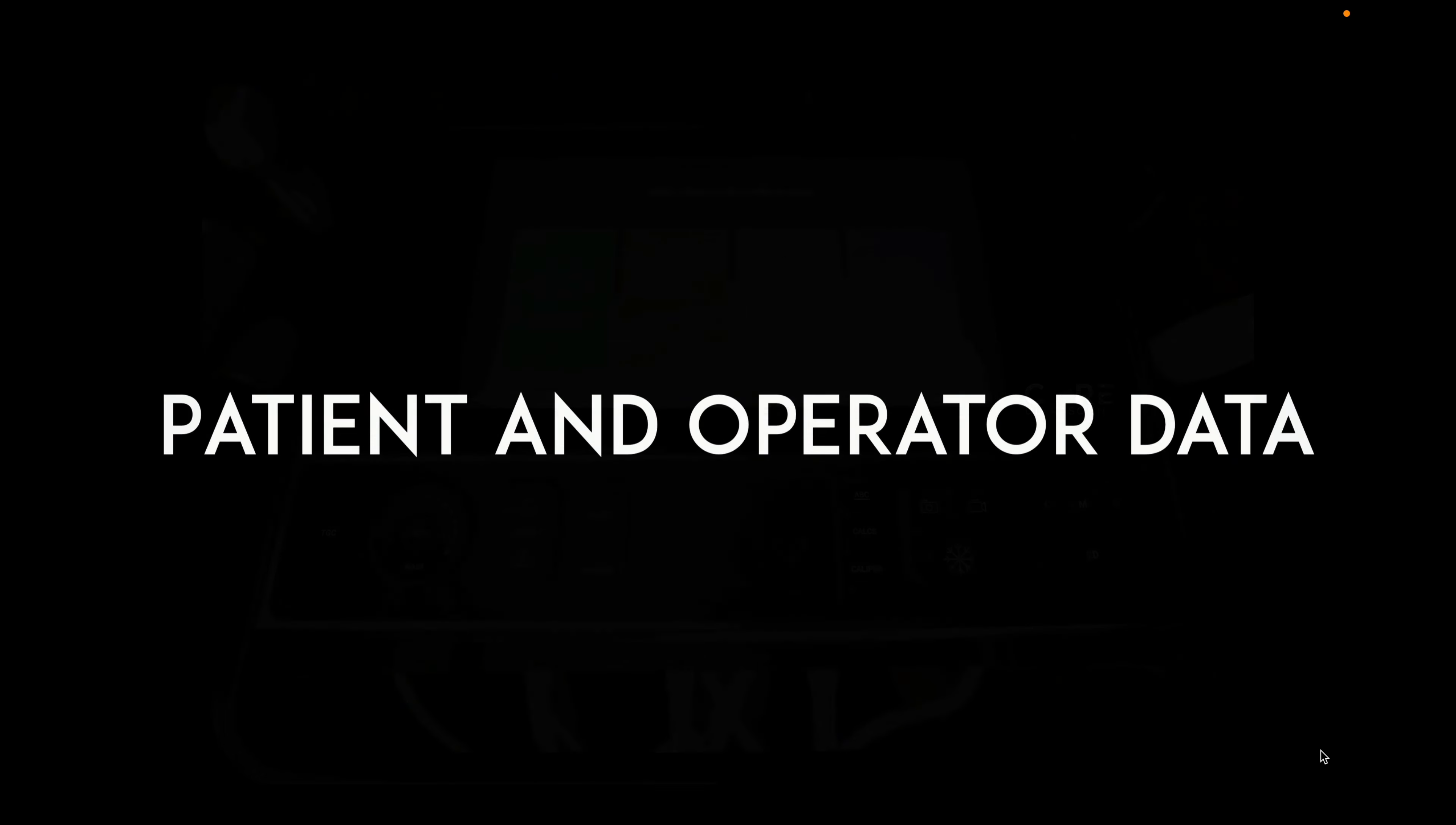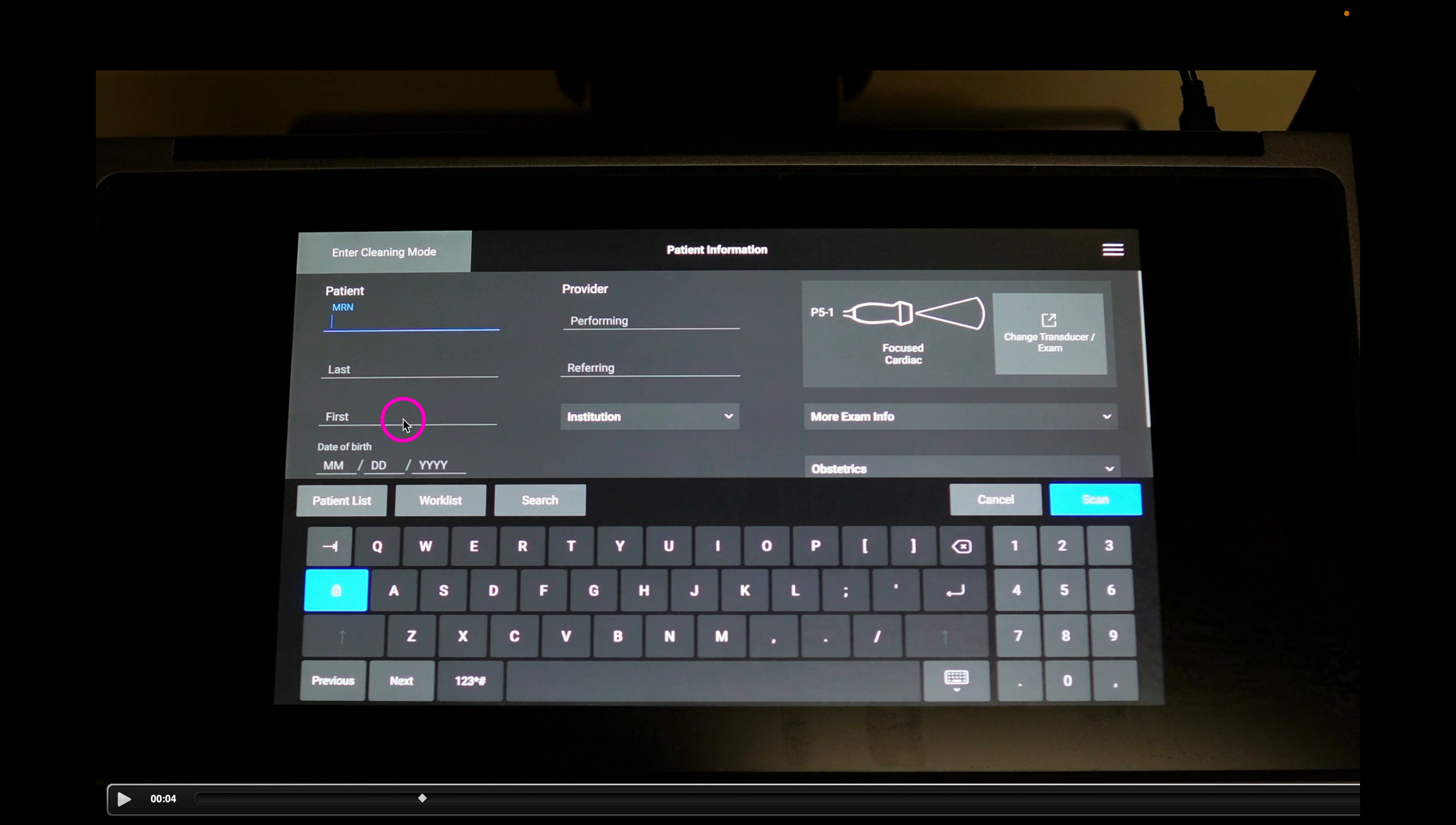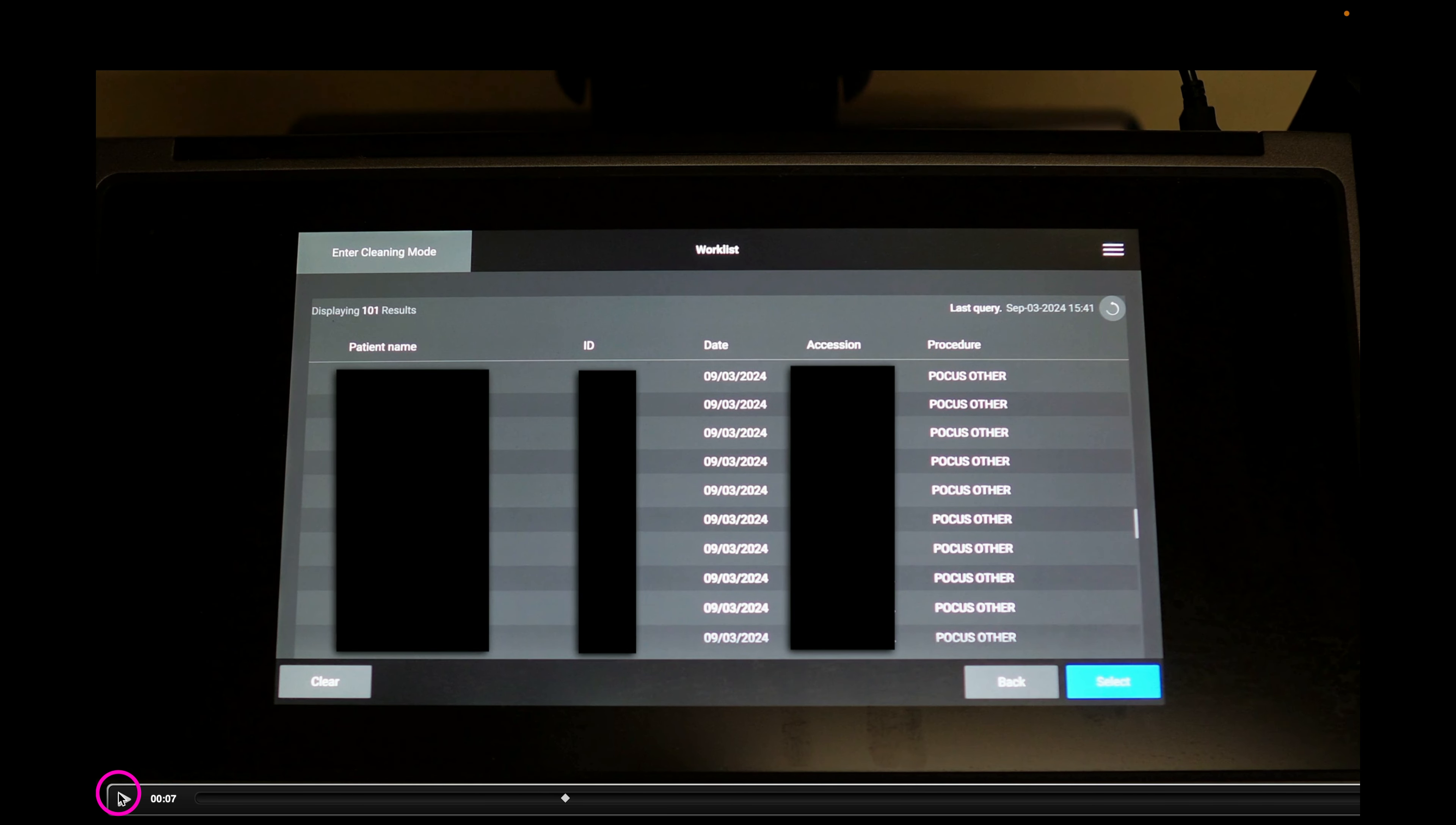Next, let's talk about how to add patient and operator data. So going back to the touch screen, you can see here it kind of tells you what it is that you need to select to be able to enter the patient information. So hit this green button right here, and you can manually input the patient's information if you don't have your system set up to be connected with your EMR. But if you happen to have it connected through your EMR with either an orders-based or an encounter-based pathway, the encounter-based pathway is obviously better. The way that you would add the patient information is you would hit the work list.